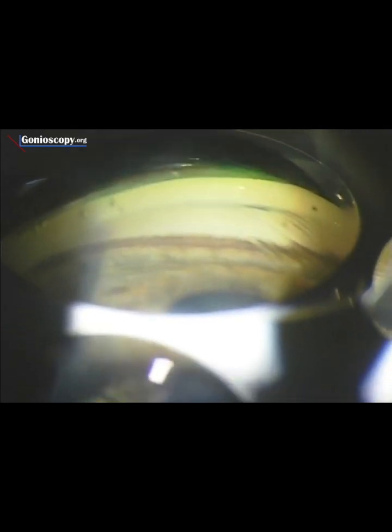Here I am pushing, you can see corneal folds, and you can see a peripheral roll. As I let up on the pressure, the iris comes back forward, the folds go away, and the iris is again flat with a very narrow iridocorneal angle. Again I'm pushing, again you see the far peripheral roll of iris. I find indentation gonioscopy to be tremendously helpful in making the diagnosis of plateau iris syndrome.